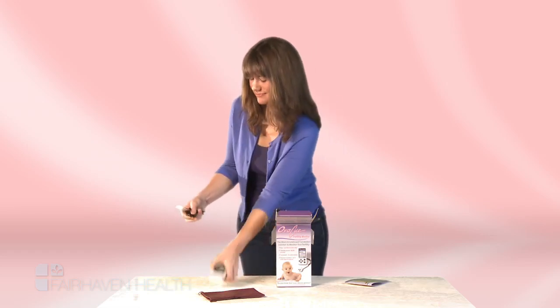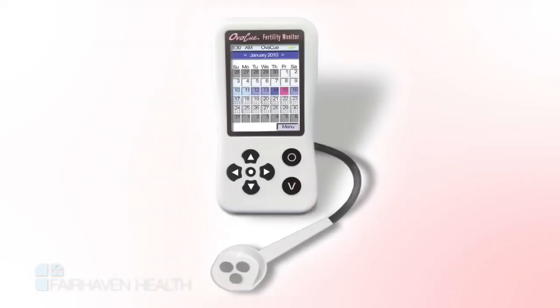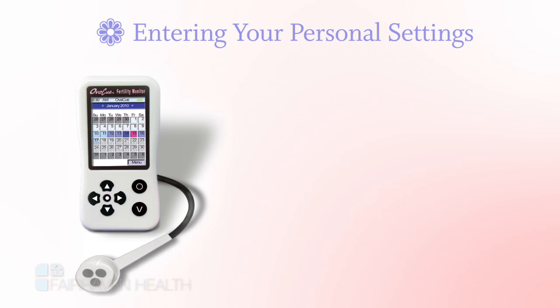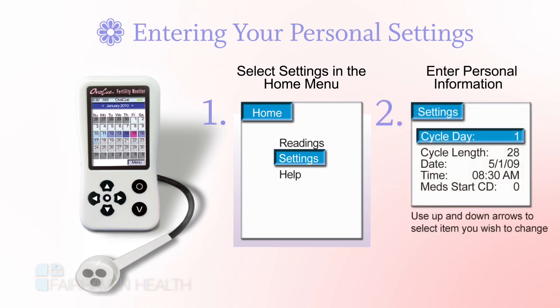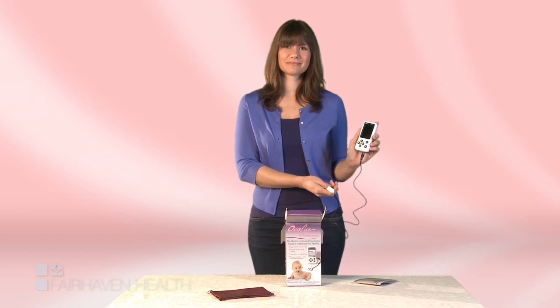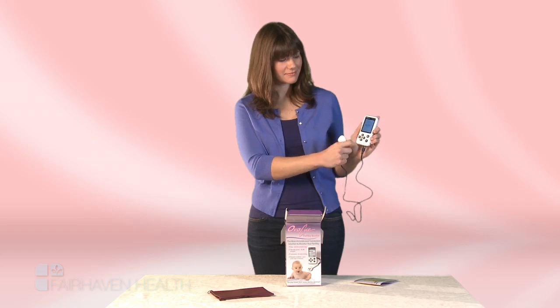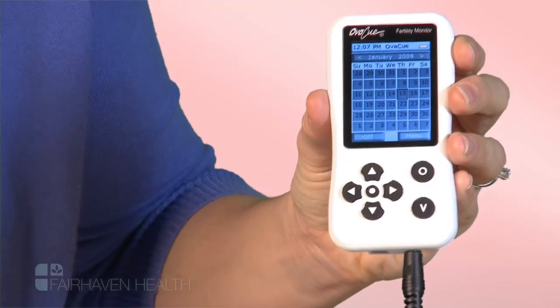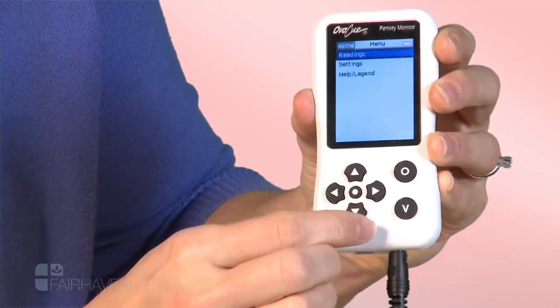To use the OvaCue, simply plug the oral sensor into the bottom of the monitor. The first time you use your OvaCue monitor, you'll need to take a few moments to enter your personal settings. Turn the monitor on by pressing and holding the on-off button, also known as the enter button, which is located in the middle of the arrow buttons. Use the arrow key to go to the settings screen and enter your current cycle day and cycle length.